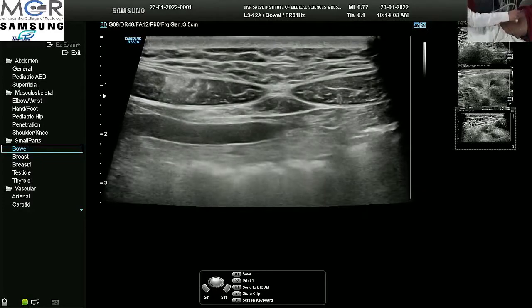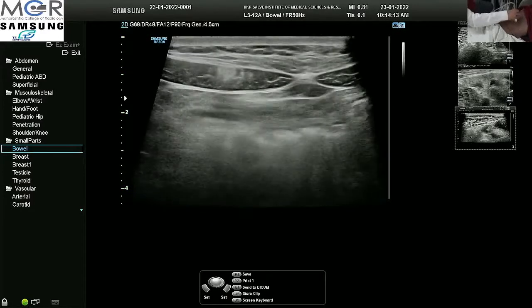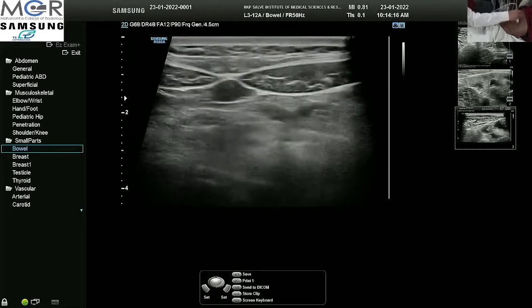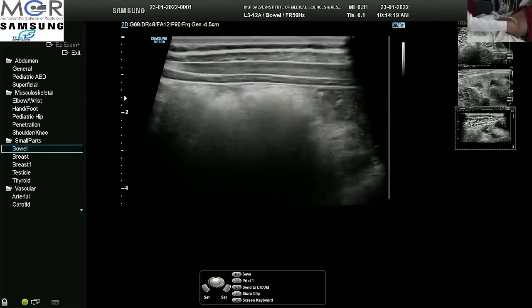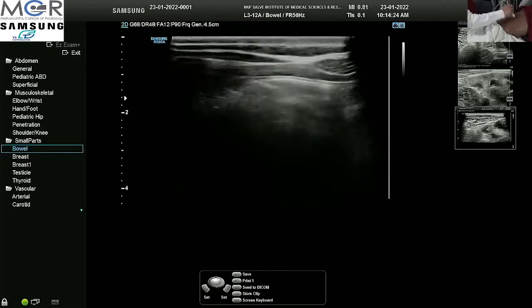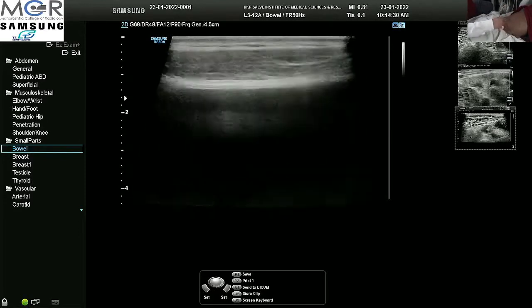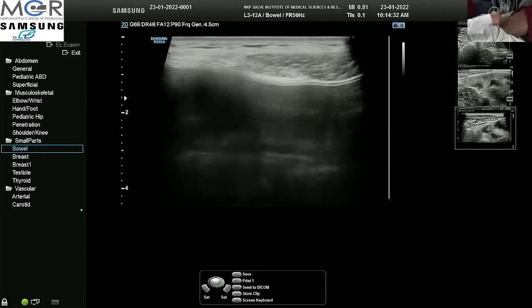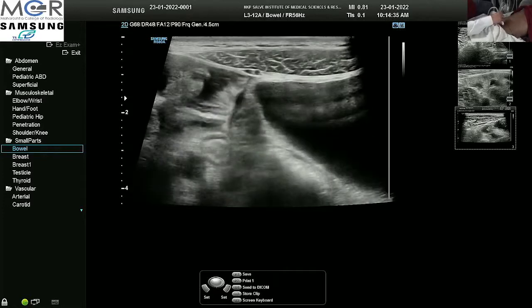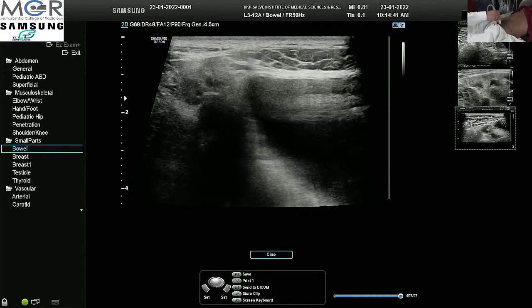This is how we can go about scanning the abdomen. One important thing to remember is that unless we specifically look for lesions in the anterior abdominal wall and particularly seek them, they may be missed — because they are superficial and may not be seen with the initial convex probe screening. I think I will stop here and we can go for cases now. Thank you.